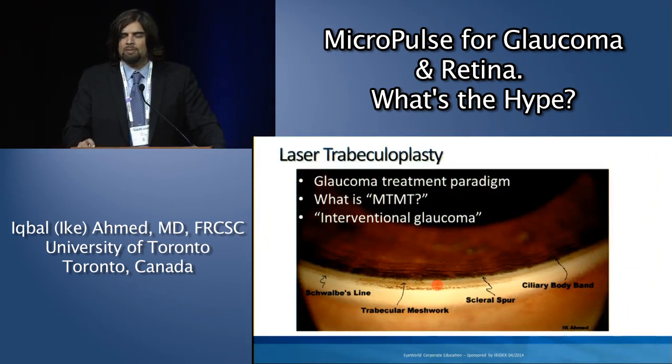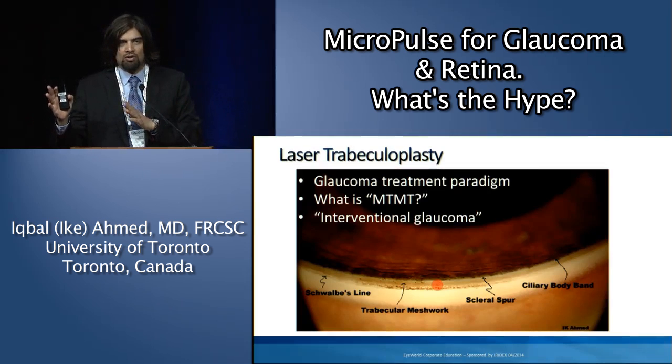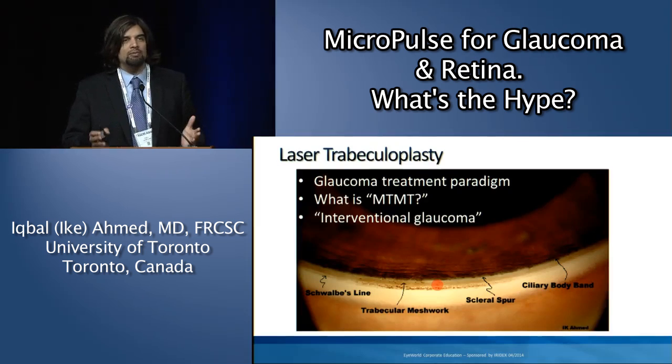So when it comes to trabeculoplasty, of course, where does it fit in our treatment paradigm? We've seen trabeculoplasty move toward earlier treatments. We're not leaving patients to pre-surgical periods where we have to go to trabeculectomy. We're typically using this second line, sometimes first line, third line. I look at it as a medication alternative.